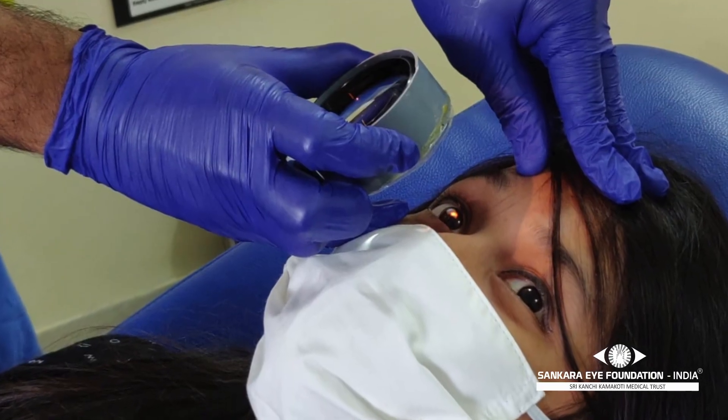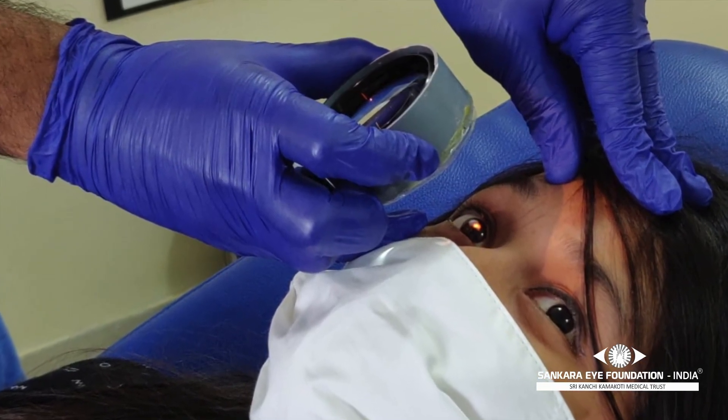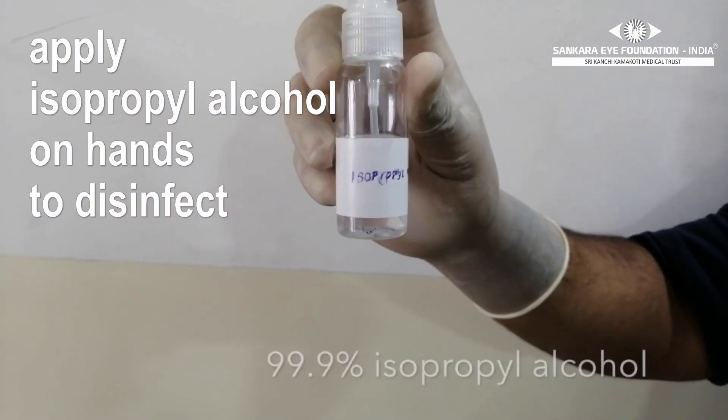As you can see, the hands of the examiner can come in contact with the patient's mask, especially while examining the periphery.